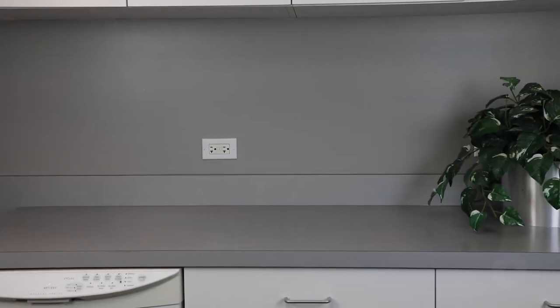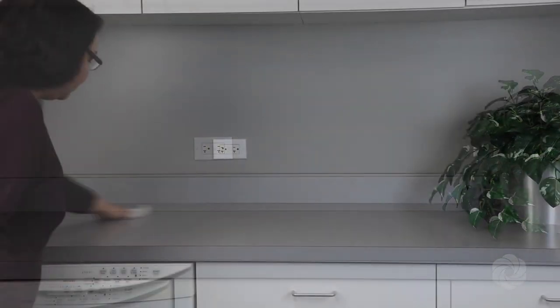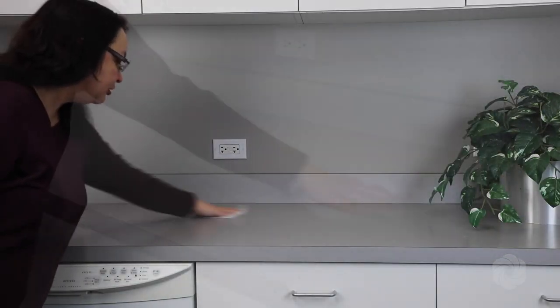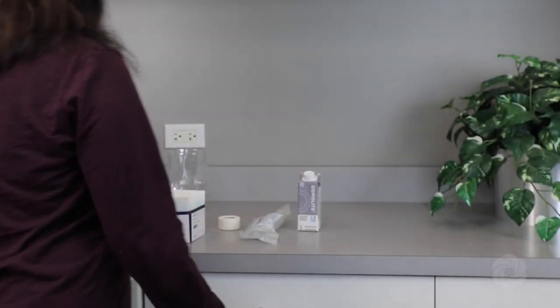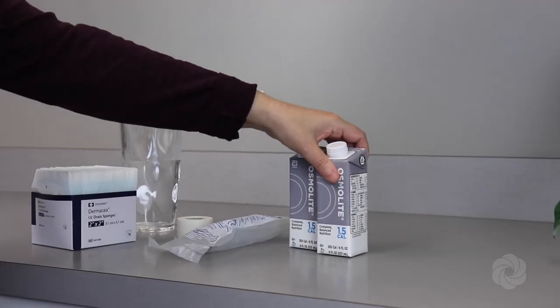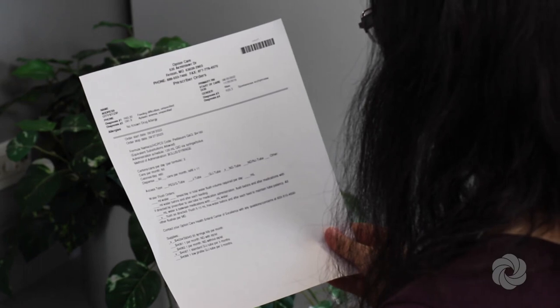Prior to preparing your tube feeding, select an uncluttered work area. Clean the work area with warm, soapy water or an antimicrobial cleaning agent. Gather all formula and supplies needed for the tube feeding. Locate the tube feeding order included in the delivery.